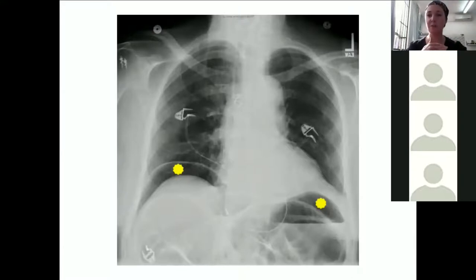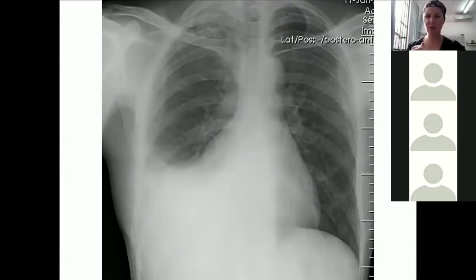So in terms of the diaphragm, you want to see what's below it. And is there something unusual below it? And then you want to have a look and see, is there something unusual above the diaphragm? So you've got a great example here on the right-hand side. You can see that you've got an area over here that's hyperechoic. You can't see the diaphragm nicely. You can see the diaphragm beautifully on the left. On the right-hand side, you can't see the diaphragm. And you don't really know what's going on here. So this could be a pleural effusion. It could be infiltrates, so some sort of a pneumonia that's obscuring the diaphragm. You can definitely say you can't see the diaphragm nice and clearly. So you're worried about this patient as well.